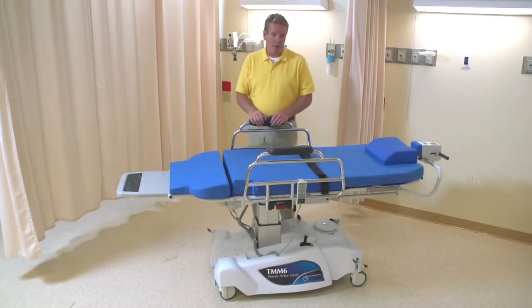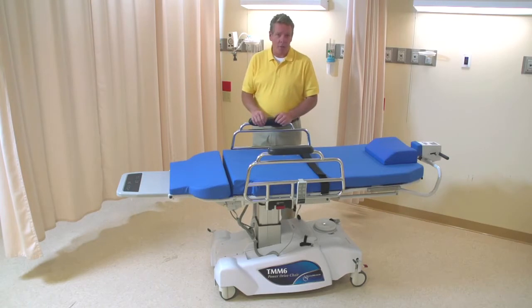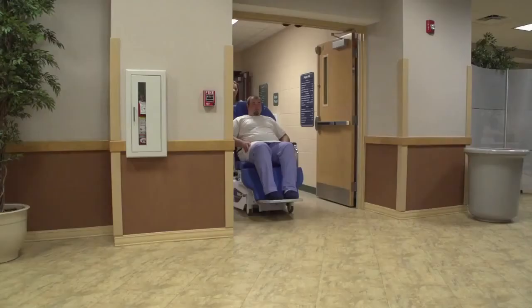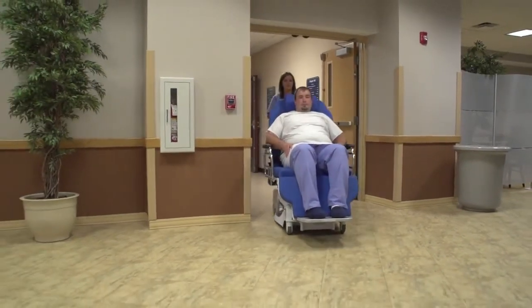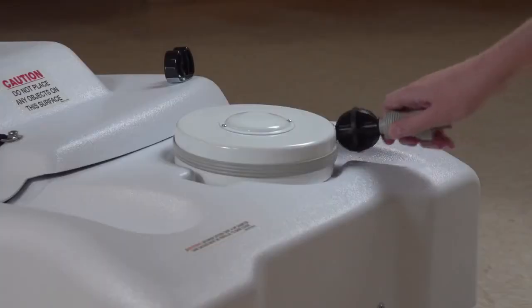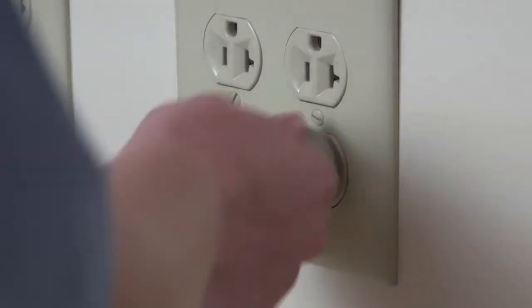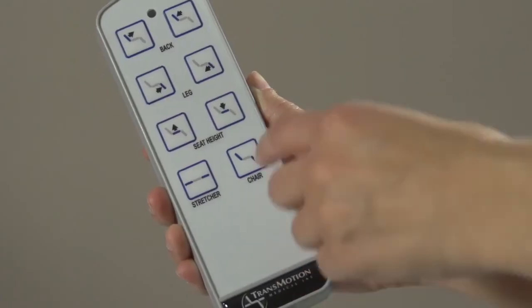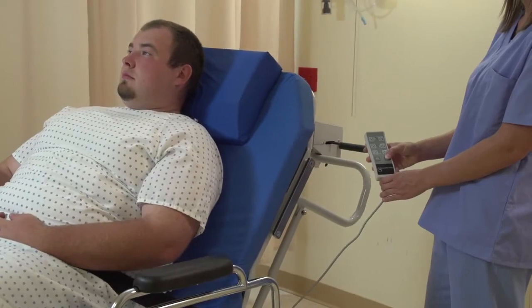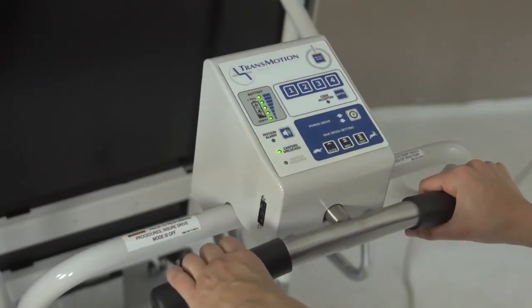Now let's talk about power. The TMM6 has 33 amp-hour onboard central batteries that power both the drive unit and the positioning controls. It gives the power drive unit a 10 to 15 mile range on a full charge. An AC cord located at the base of the chair plugs into a wall outlet to charge the battery. When the AC cord is plugged in, the chair's positioning pendant will operate, but the power drive's user interface cannot be turned on.